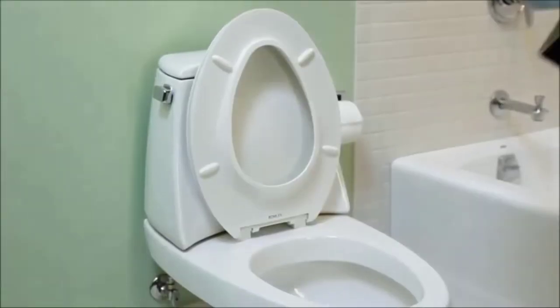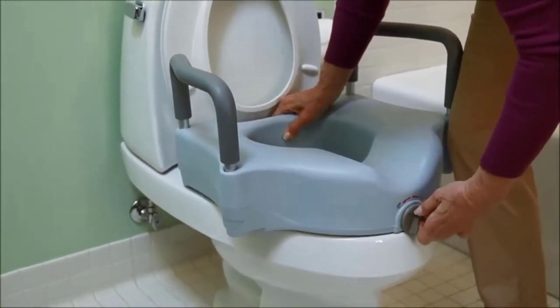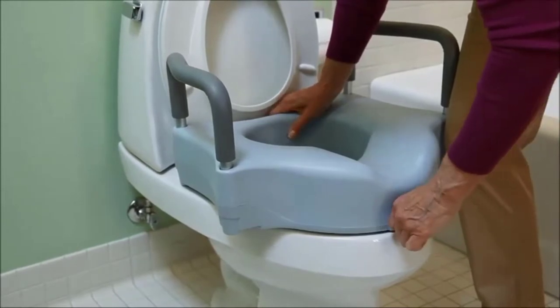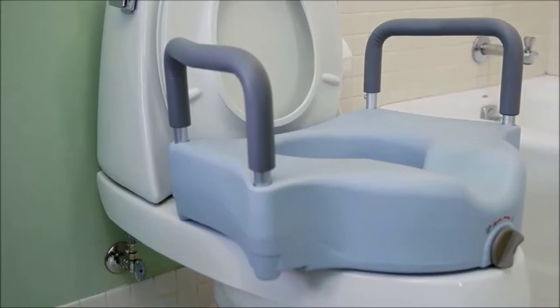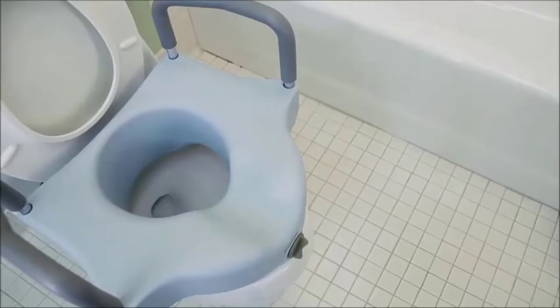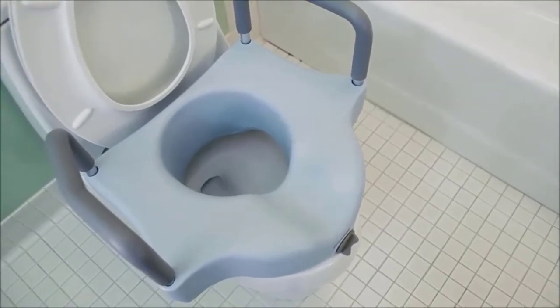The raised locking toilet seat features a front clamping mechanism that locks the seat onto the toilet so you don't have to worry about it coming loose or shifting during use. The wide contoured surface raises the seat level by 5 inches and fits most toilet bowls from 11 inches to 14 inches long.